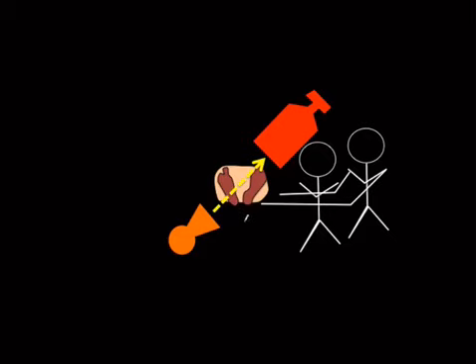So you don't want to be like, oh, we got to lower the table because I'm short. You should stand on a platform to keep this distance big. Or you can have your trainee stand on all fours, sort of like a dog, and you can step on their back during the procedure also, if that's more comfortable, or if a platform isn't available.